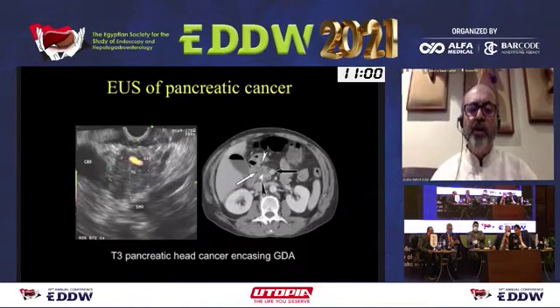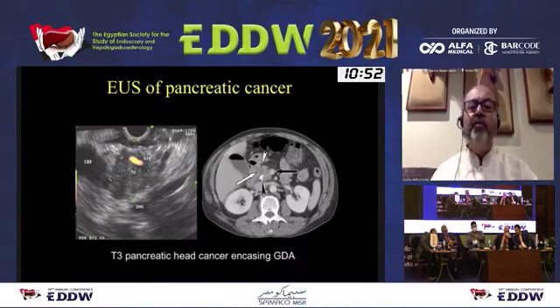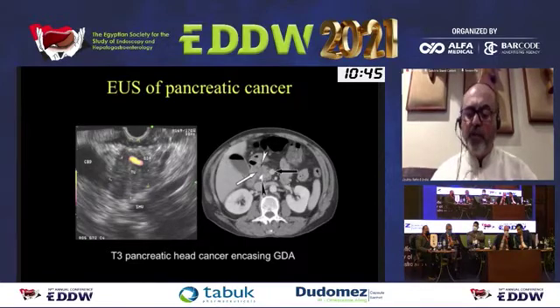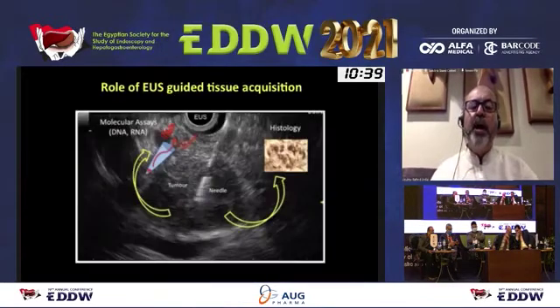And that's what I'm waiting for. So if you look at a primary tumor which is invading the gastroduodenal artery, similarly the superior mesenteric artery and hepatic artery, or even the celiac artery, especially in cases of a body of pancreas tumor, then it becomes extremely difficult for us to resect this patient, which you will also agree will have very poor prognosis.